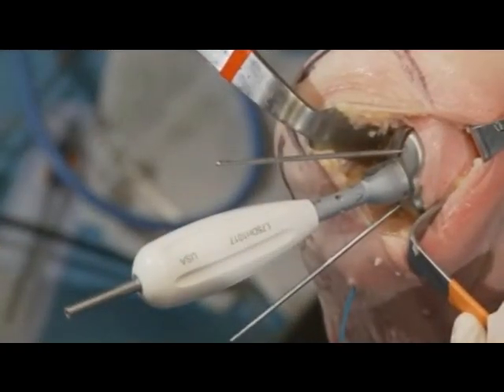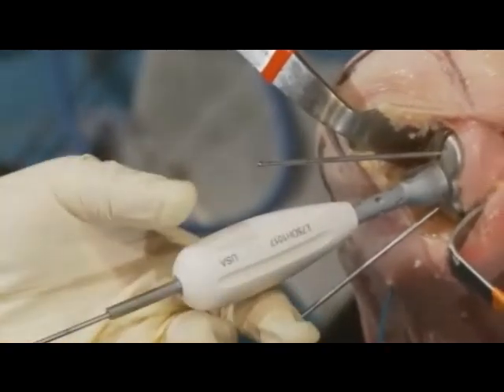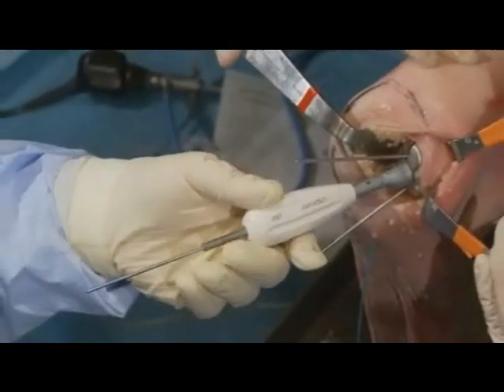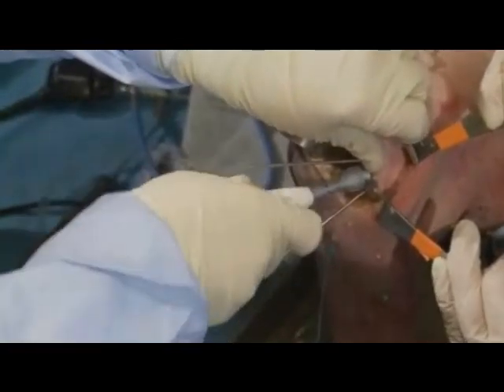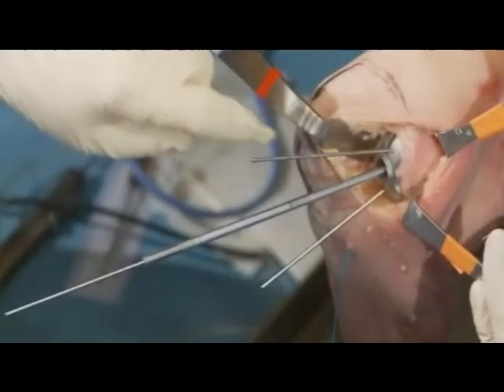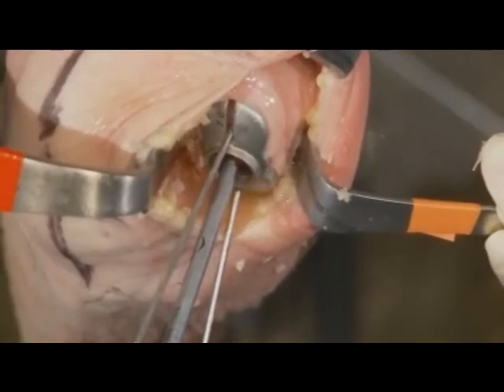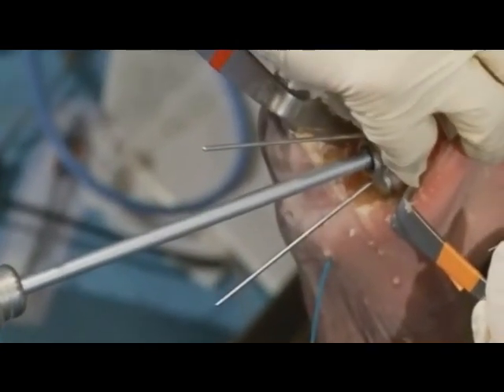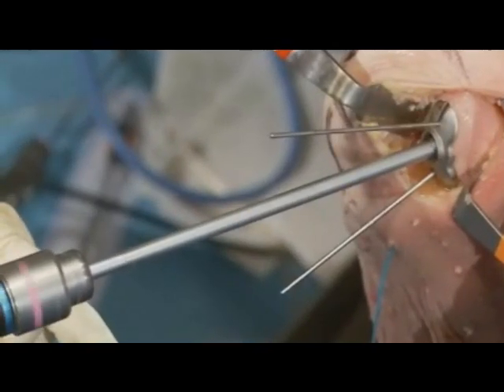We take our pin. This is our pin, and we want to make sure that we maintain this axis, and we want to tap it back in. Then we take this out, leave the drill in place, and now we're going to cut a slot to start our screw hole, and then we're going to tap it. This is just a step reamer. It comes down over top of the centering shaft, and it also has a window in it down here that tells you the depth that it needs to go to.